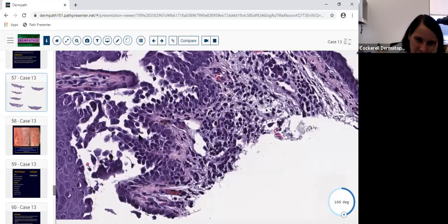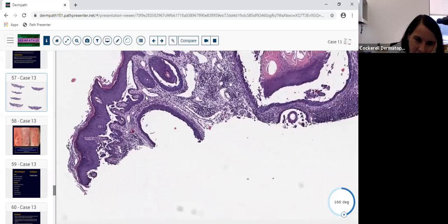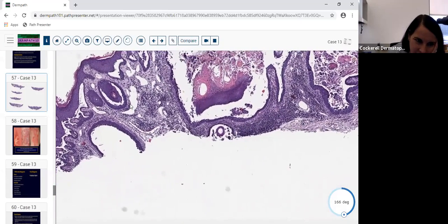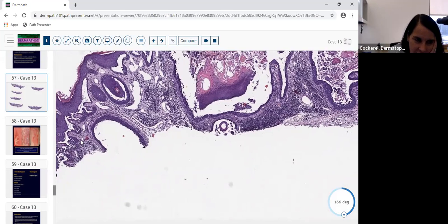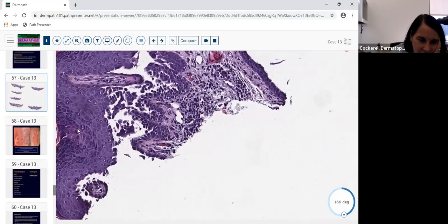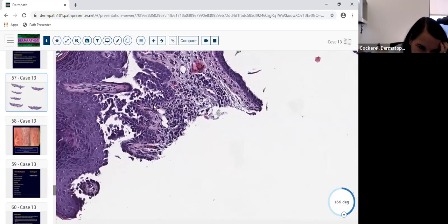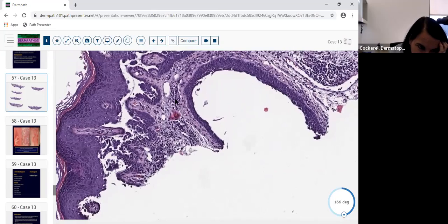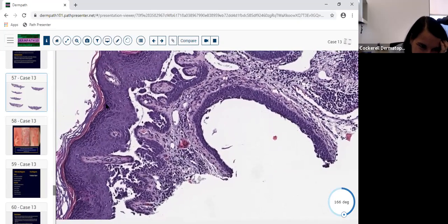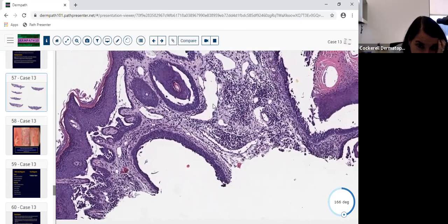But herpes usually isn't this widespread. You'll see foci of acantholysis, and it can go down the follicle in herpes. But the other thing in the differential is Hailey-Hailey, okay? And this is going down the follicle with these villi, and you're not seeing full thickness acantholysis into the granular layer, which you'd see more of, the dilapidated brick. This is more of the tombstone and the villi, which is the buzzwords for what? Pemphigus vulgaris. And it's not foliaceus because it's not subcorneal. So I think we have the diagnosis even without the direct immunofluorescence.